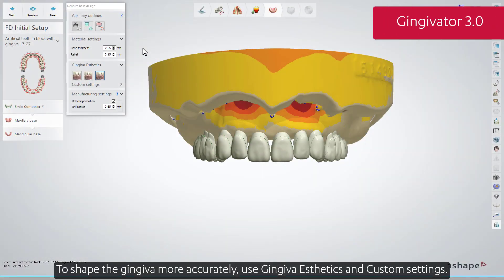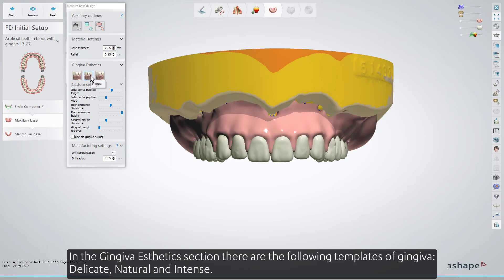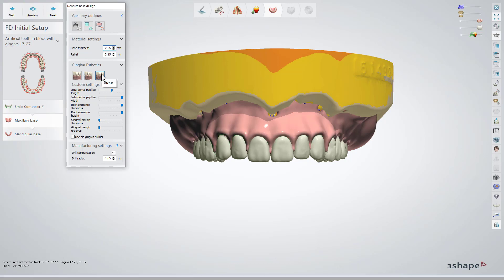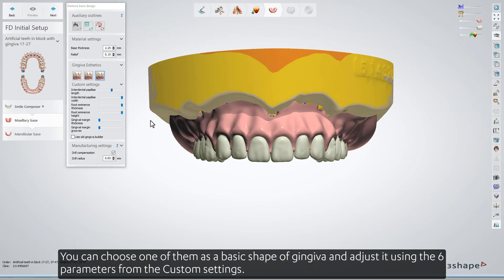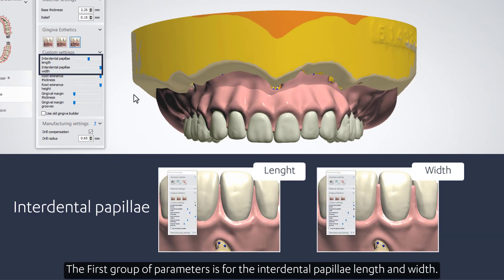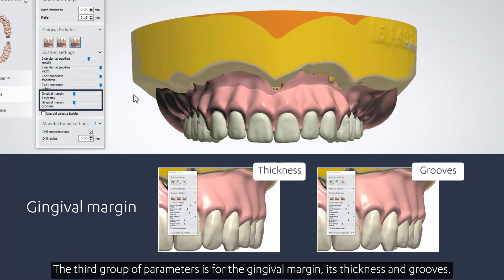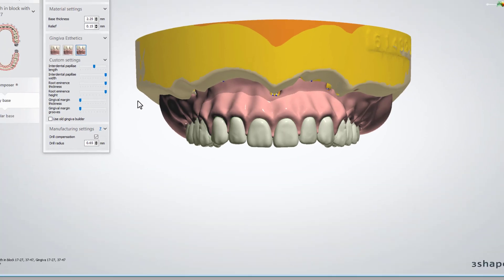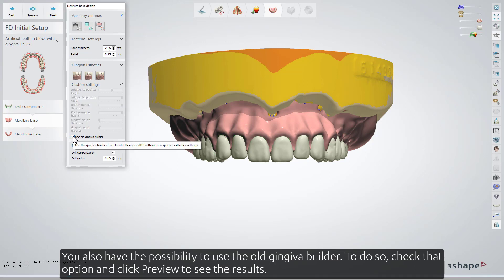To shape the gingiva more accurately, use Gingiva Aesthetics and Custom Settings. In the Gingiva Aesthetics section, there are the following templates: Delicate, Natural, and Intense. Whenever you wish to see the results, click Preview to generate the base. You can choose one as the basic shape of the gingiva and adjust it using the custom settings parameters. The first group is for the interdental papillae length and width; the second for root eminence thickness and height; and the third for gingival margin thickness and grooves. You also have the option to use the old gingiva builder — check that option and click Preview to see the results.